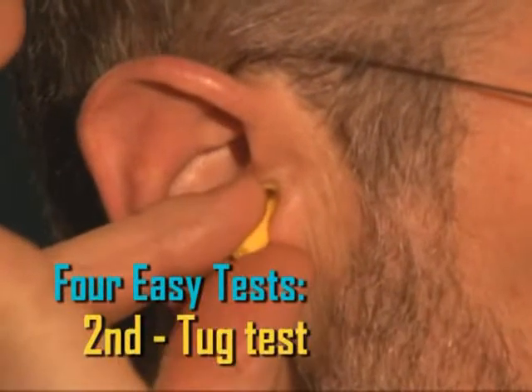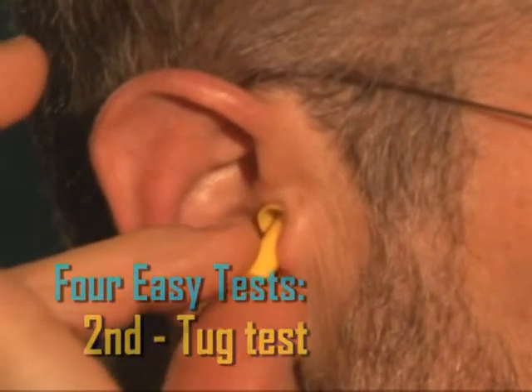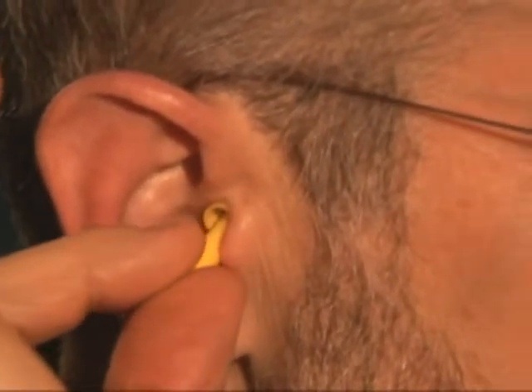The next two tests — the tug test and the pump test — rely on the fact that for a plug to be well fitted, it must make an airtight seal within the ear canal. So for example, if you try and remove the plug by gently tugging on it, you will notice that there is resistance, as if you were trying to remove a stopper from a bottle.